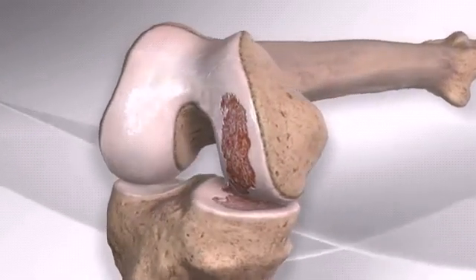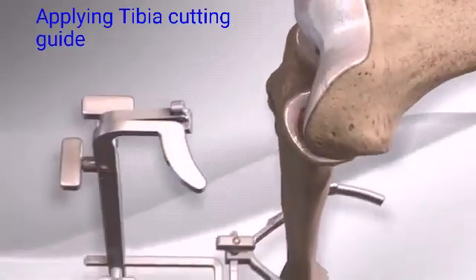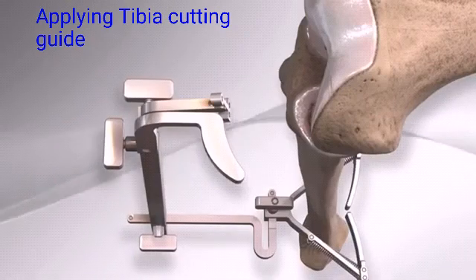After your surgeon makes a small incision over the front of the knee, a guide is secured to the tibia and used to determine how much of the tibia to remove.